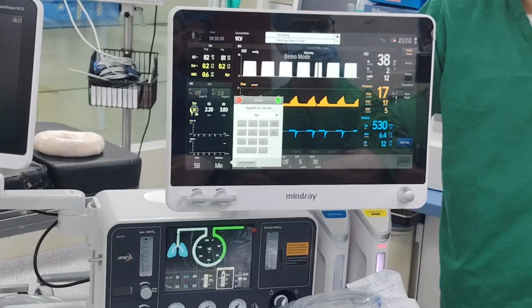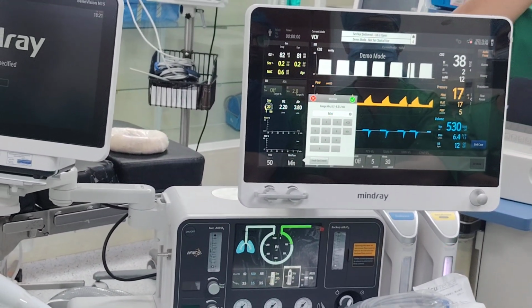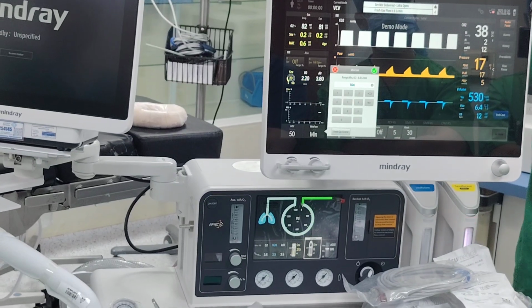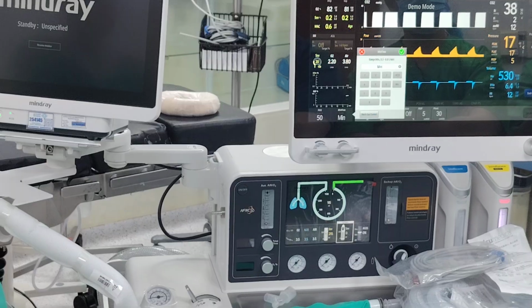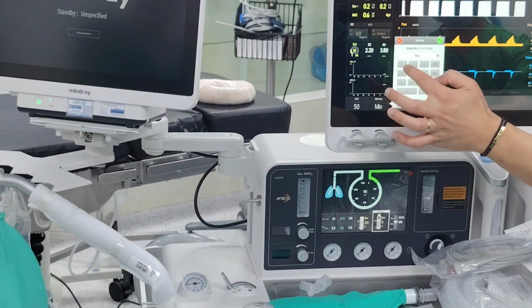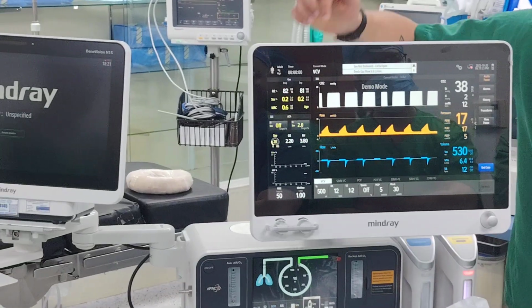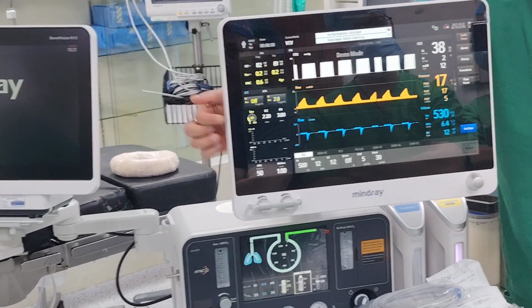But if there's a leak, what happens? You have to increase. Here, don't care, the machine will increase for you. Now, some doctors will say, I don't care about 0.3, I don't want 0.3, I'm very uncomfortable, I'm afraid. Fair enough. You can tell the computer, you're not allowed to go under 1 liter. You're not allowed to go down less than 1. Very simple, look. You click here, minimum, put 1. So now you tell the computer, the lowest you can go is 1 to reach these targets. Okay? Is it very clear?